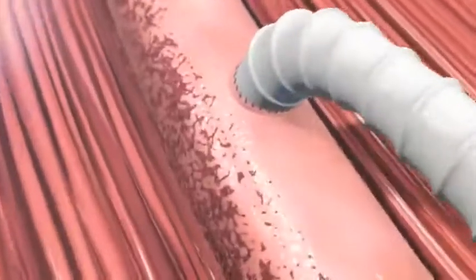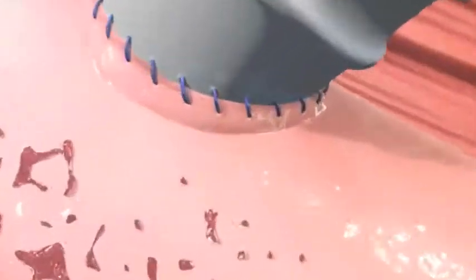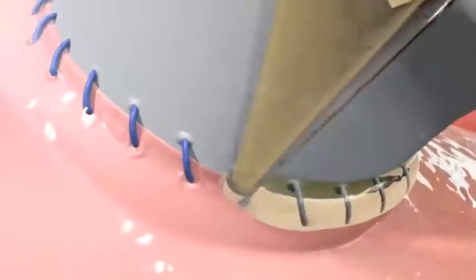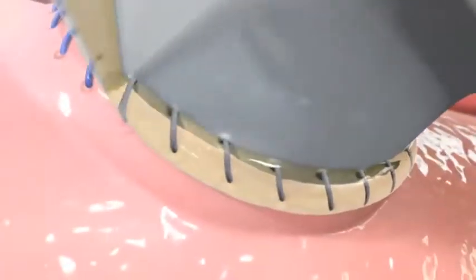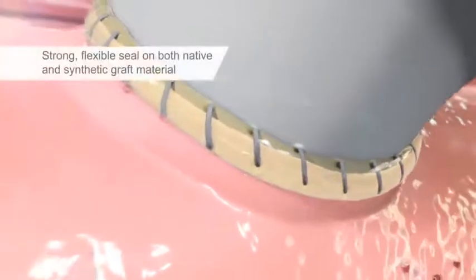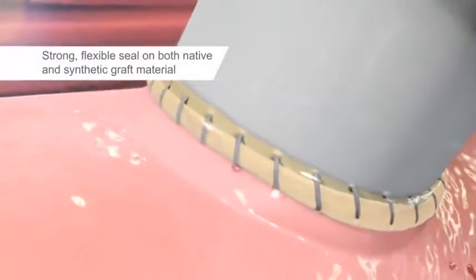Previleak is appropriate in a wide range of procedures, such as aortic, extremity bypass, carotid, hemodialysis access, and grafting. It effectively seals needle holes in both synthetic grafts and native vessels, and works equally well on large and small vessels.